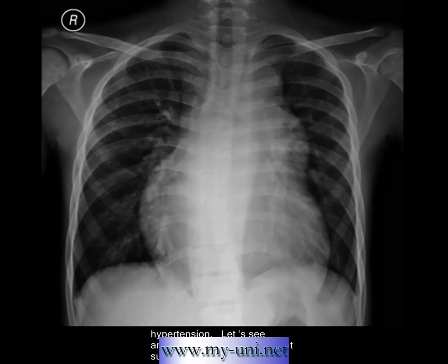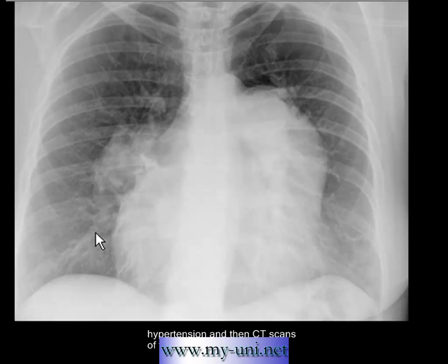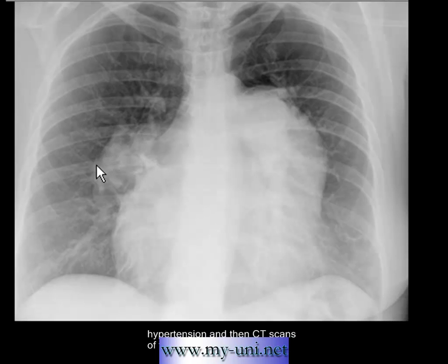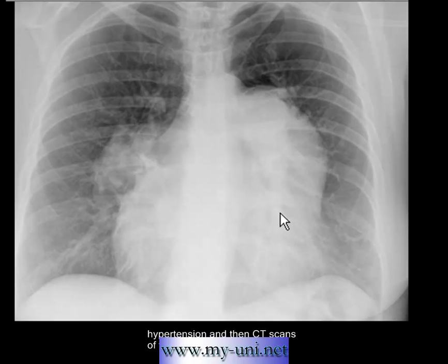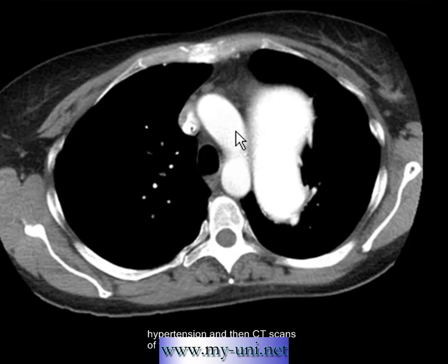Here is another chest X-ray of a patient with pulmonary arterial hypertension. You can see cardiomegaly, a hugely enlarged main pulmonary artery, and the interlobar branch of the pulmonary artery posterior to the main pulmonary artery shadow. Notice especially the right pulmonary artery — it is sharply tapering as it enters the lung parenchyma. The same cone-shaped tapering structure is visible on the left side, representing the interlobar branch of the left pulmonary artery.